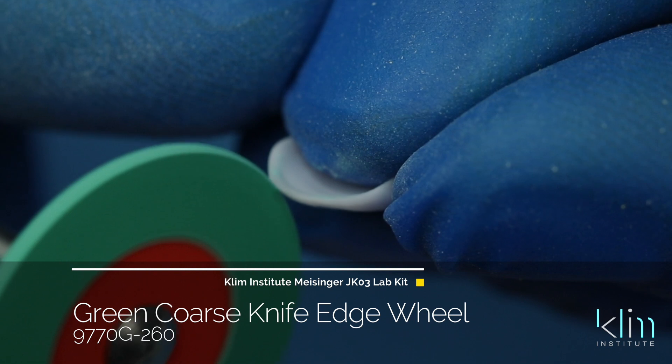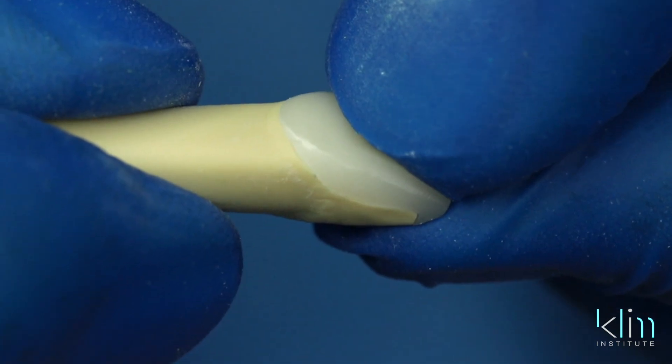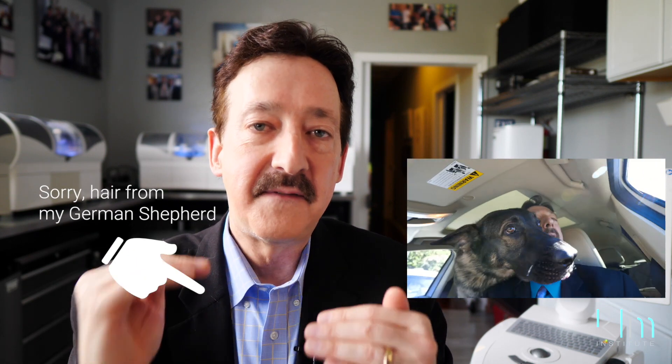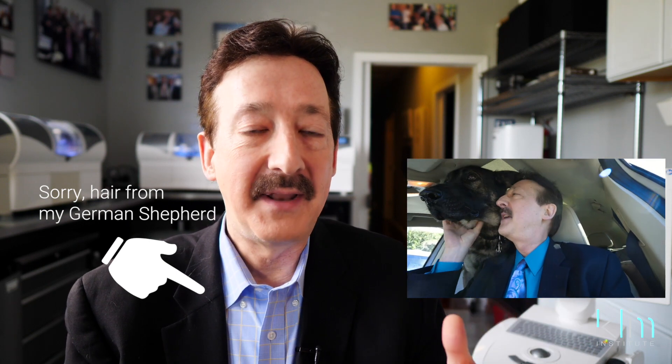That's how we set up our MCXL — it's really important to know that because when you mill it out, you don't want any chips. Once the restoration is milled out, we're going to thin the margins twice in the blue state: pre-crystallized and after it's crystallized. That's where you really get that knife-edge margin where it's pressable and there's no gaps or seam. Most of my anterior restorations are done with this conservative, thin, feather margin. The current software, milling unit, and burrs we have will allow us to do that.